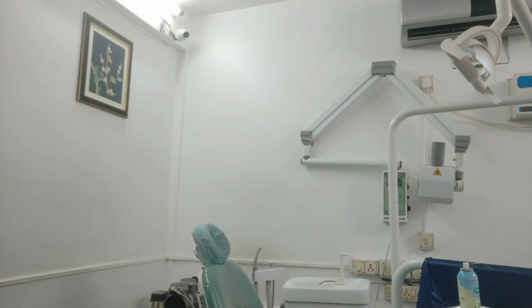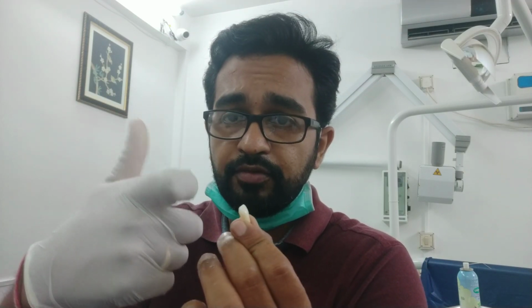So this way, after this you have to do the irrigation. Irrigation means you have to take the syringe. A syringe is required for this. After taking the syringe, you have to put it inside this access opening, and irrigate it with a lot of saline and a lot of sodium hypochlorite 3%, right? So once all the debris comes out, you have to proceed with the next file, which is the number 10 file. So this is again the 10 file. After proceeding with the number 8 file, again you have to do it with the 10 file. Before that you have to do irrigation, which is very much required.